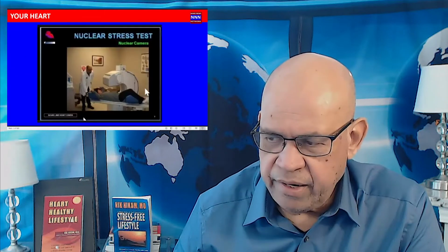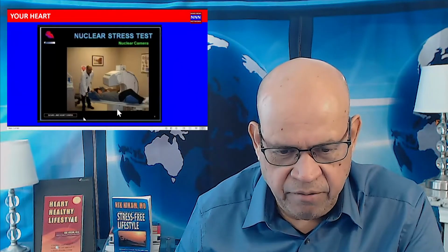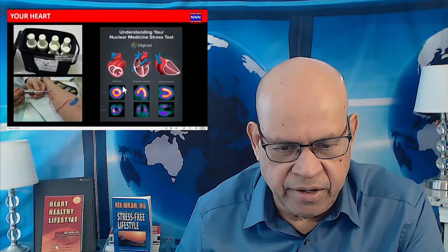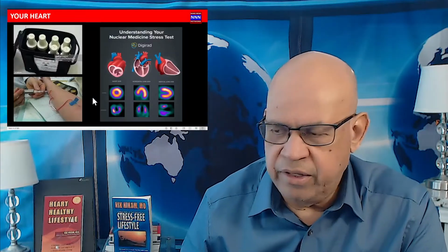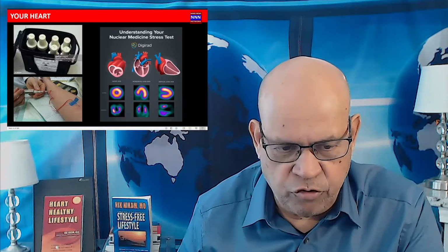And here is a video I did almost more than 10 years ago when I had a nuclear camera in my office. You can go and watch this video on my YouTube channel, which has a lot of useful information. I'm going to get you an updated information about the basis of nuclear stress test and how we do it, so you get a virtual tour.